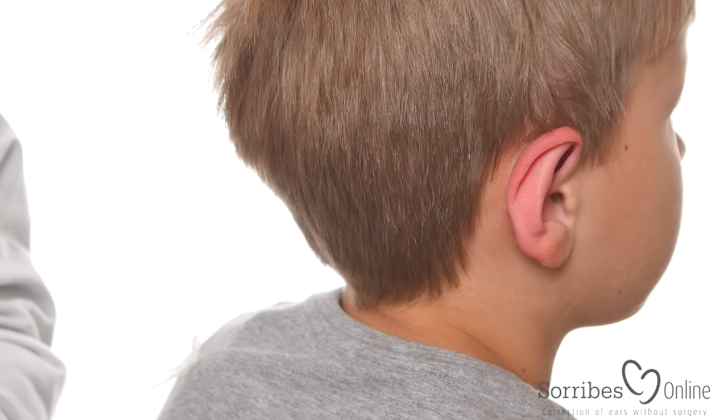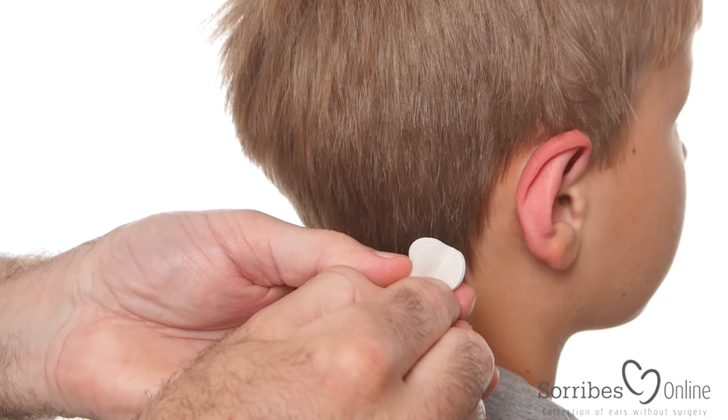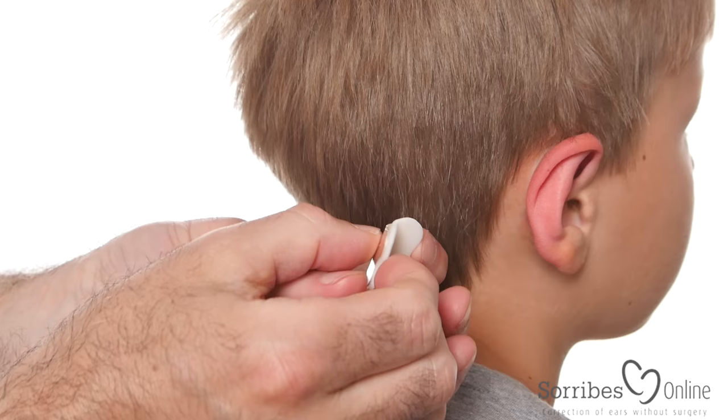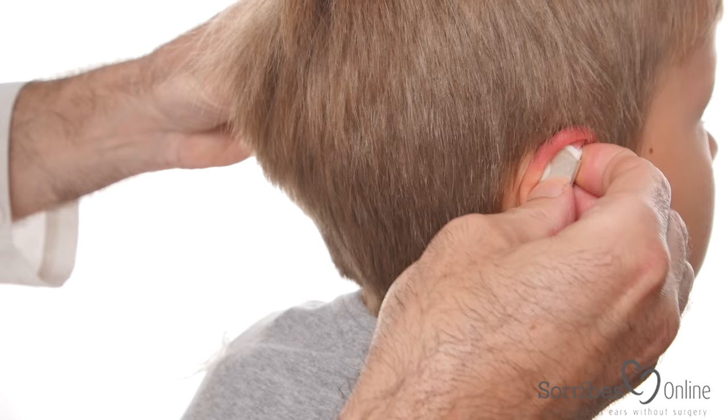Then you attach the silver clip. The silver clip is mounted with a foam pad to protect the ear against the silver. You take off the film — it's adhesive on both sides. Then you attach it to the fold of the ear we just made, and squeeze firmly with your fingers with all the strength you have. This doesn't hurt.